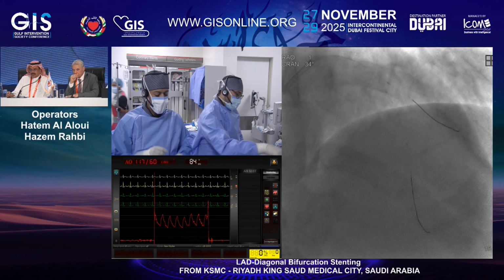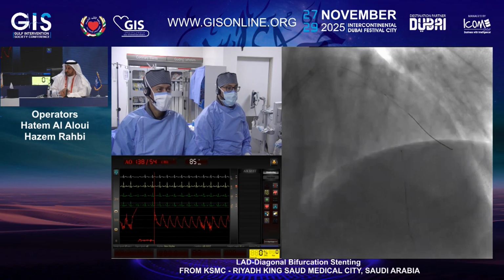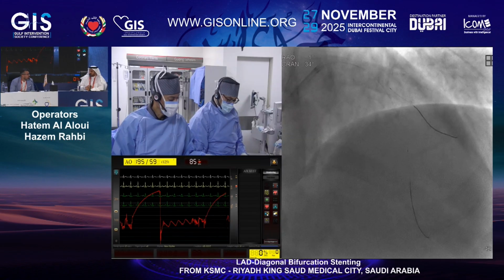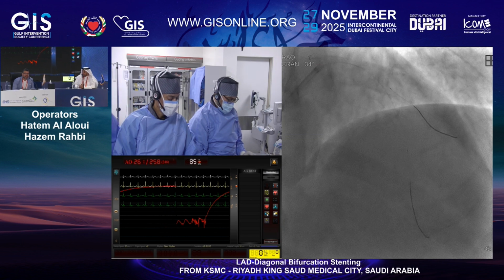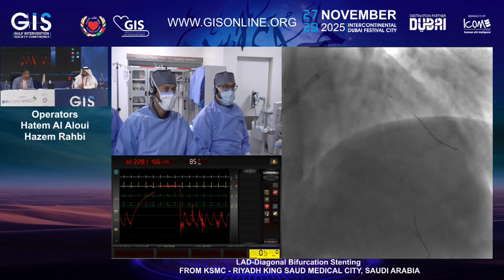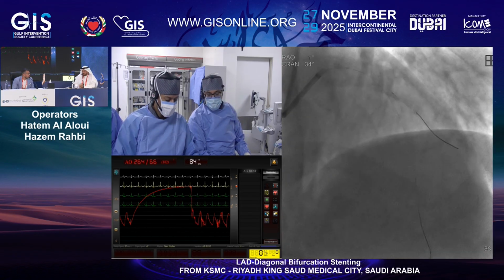While the size of the vessel on IVUS is 3.0, they used 2.75 here. Would you use a 3.0 balloon, or is 2.75 enough here? Yeah, for a scoring balloon, especially a cutting balloon, you need to undersize. So 2.75 is very good. The choice of cutting balloon here is because the Achilles heel for DCB is vessel preparation. From IVUS, we had some calcium and fibrosis. So it is a balloon of choice for me. And then I would use an NC 3.0 at nominal pressure, just to make sure that the vessel is really nicely prepared, and then apply this.